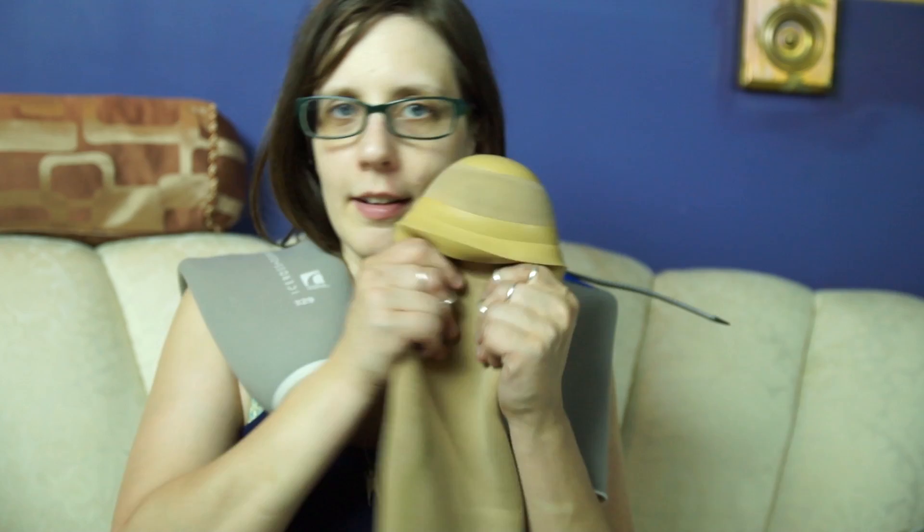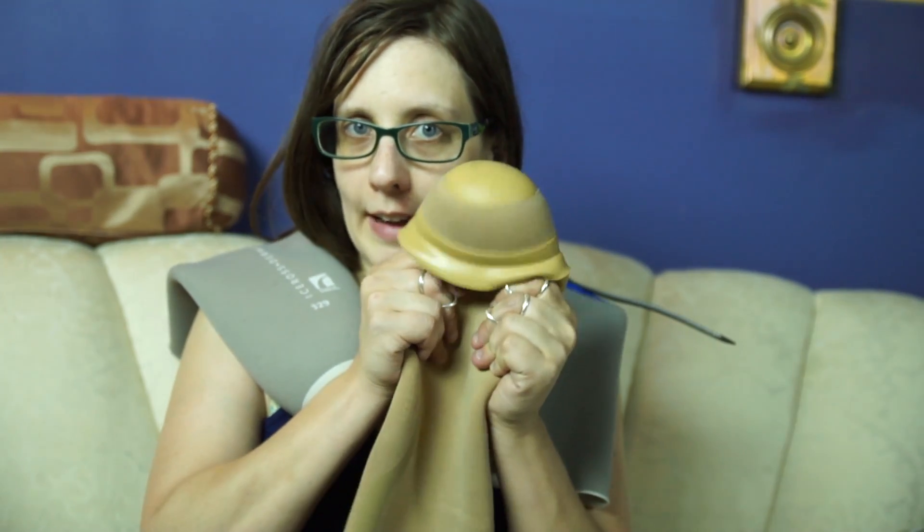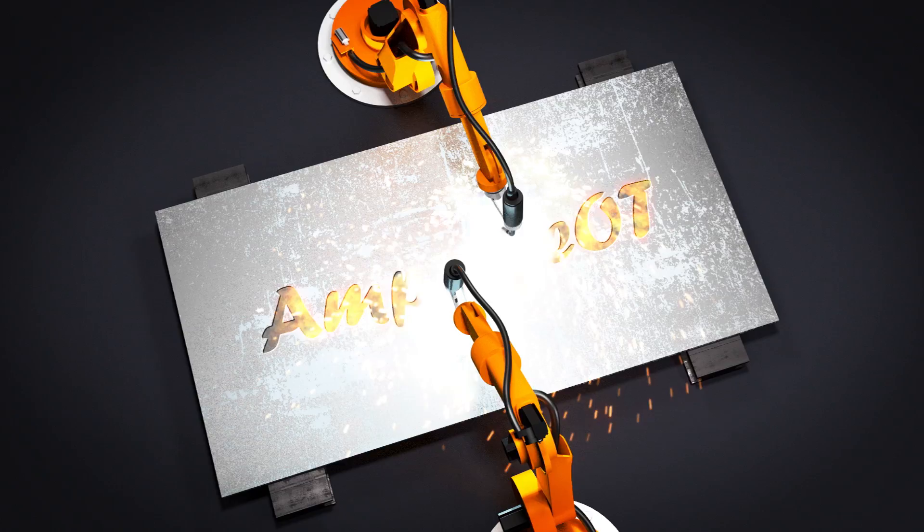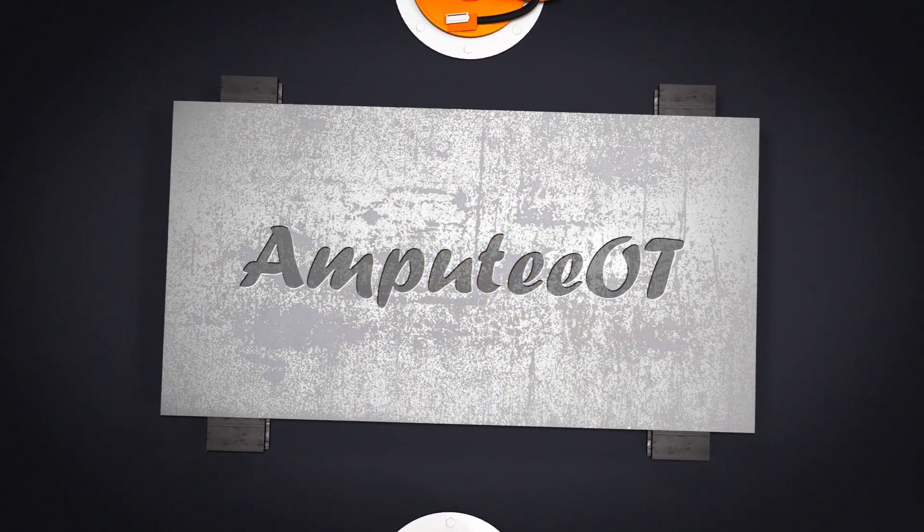Hi guys, this is Kristina, the Amputee OT. In this video, I'm going to be talking about liners for your prosthetic leg. I only have a few examples of the wide, wide variety of liners that are available for people with lower extremity amputations who wear prosthetics.